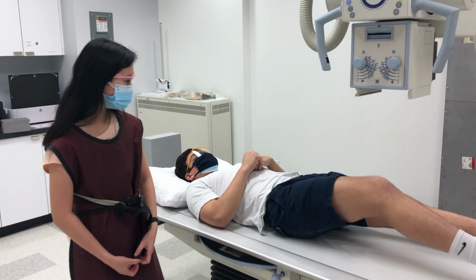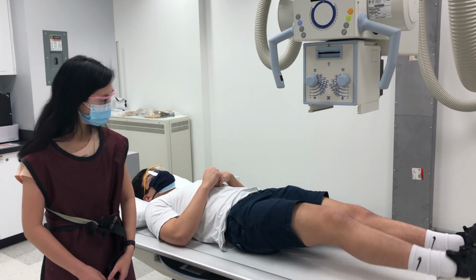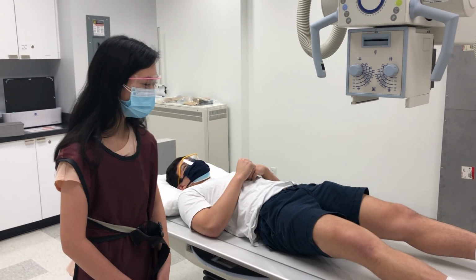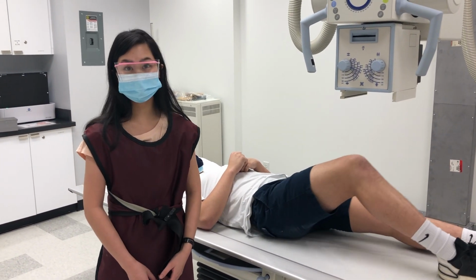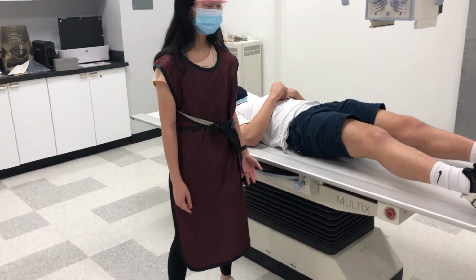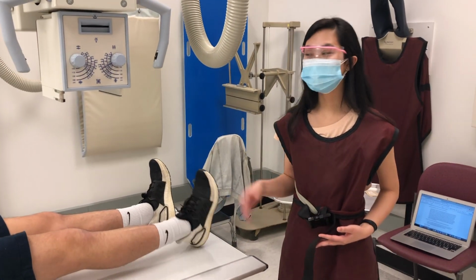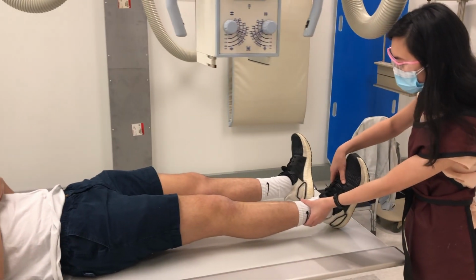Can you keep your leg still for the x-ray? Can you keep it still? Okay, so he won't keep his legs still. So if there's no immobilization device, what I may need to do is stay in the room with a lead apron and hold his legs still so we can get the picture and so there's no movement. And I need to wear this lead apron, otherwise I might get unnecessary exposure and you want to be as safe as possible. So keep that still.